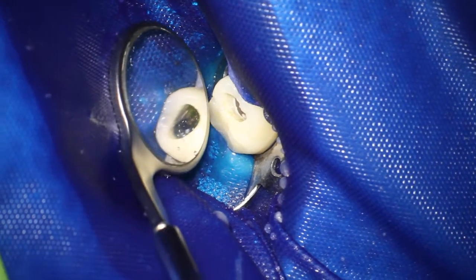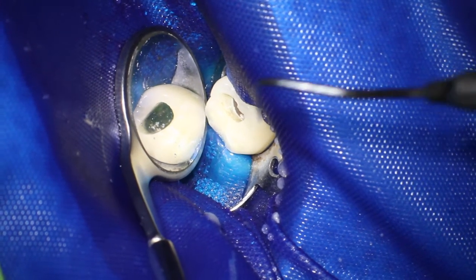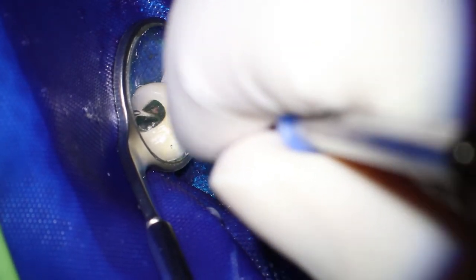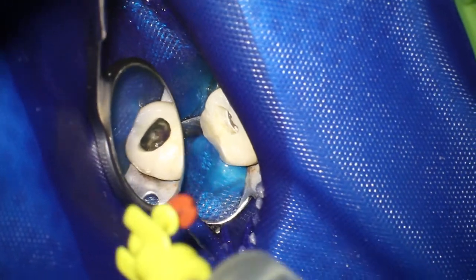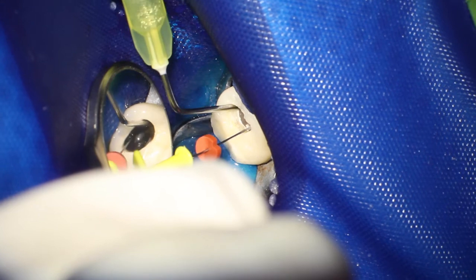The major application for ultrasound is the dissolve of vital or necrotic tissue in the canal. In this example, one can see it very clearly. The combination of sodium hypochlorite and ultrasound makes it a very reliable method to remove any tissue. Here you can see a lower molar where the mesial canals confluent. There is a lot of necrotic tissue that has to be removed. With sodium hypochlorite, I began to irrigate the canal to rinse out the big parts of tissue.